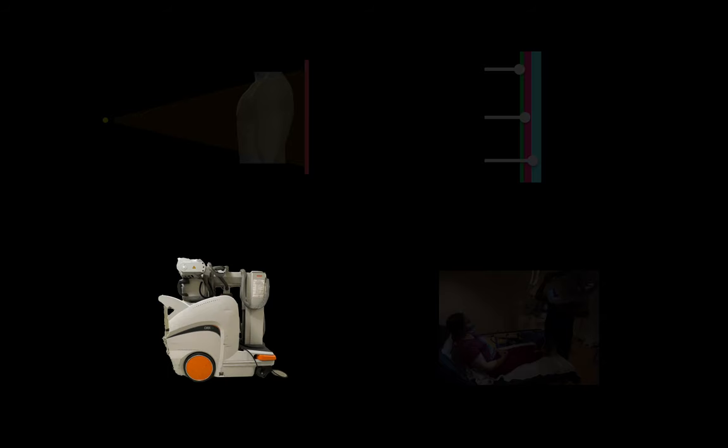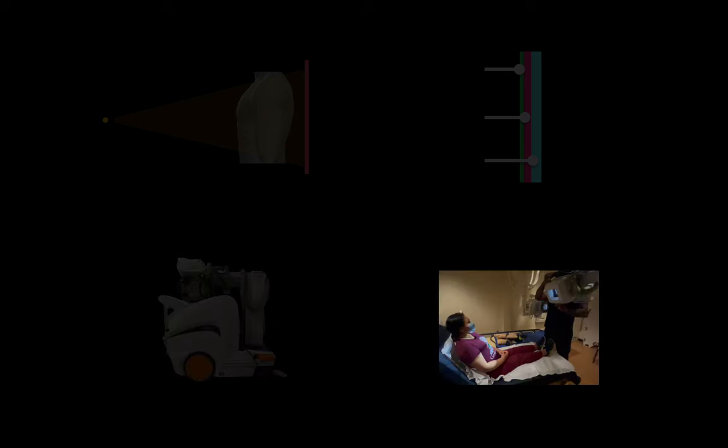We'll tackle this talk in four parts. We'll start with some x-ray basics, and then explain how traditional x-ray films and modern x-ray detector panels work. We'll give you a tour of a portable x-ray machine, and finally show you how an x-ray tech shoots a chest x-ray of a patient's chest.